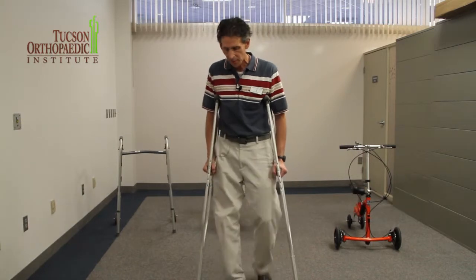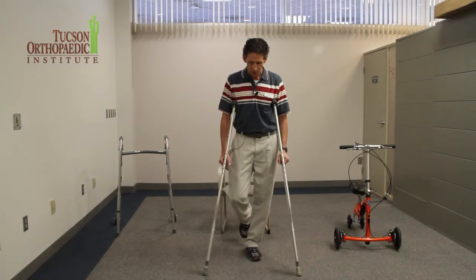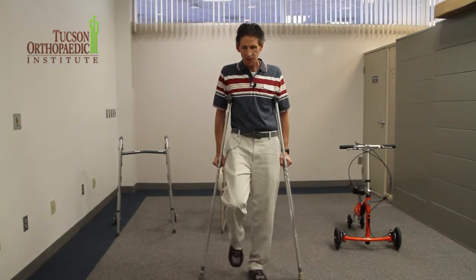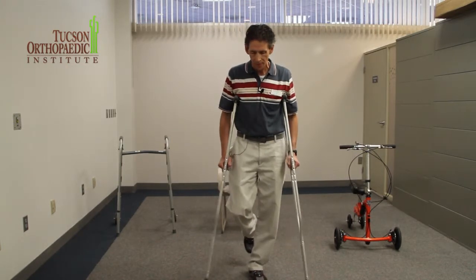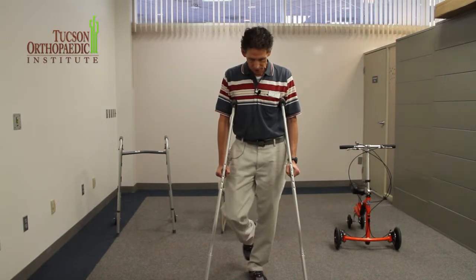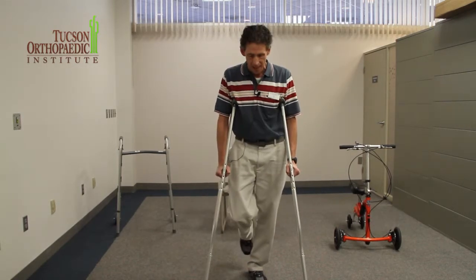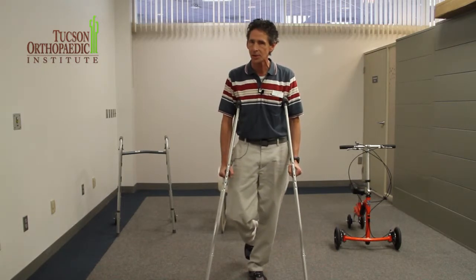What people sometimes do wrong with the crutches is they step right to here, so then all the points are in line, and you can come over and easily knock me over. So this is a hard thing for people to get, but if you put the crutches out in front and my leg back here, keeping my weight off it because the doctor doesn't want me to put any weight on it, then I'm pretty stable — it'd be harder to knock me down because of the triangular base.